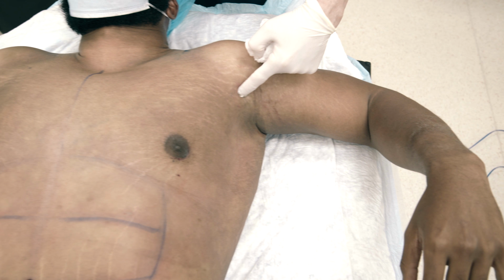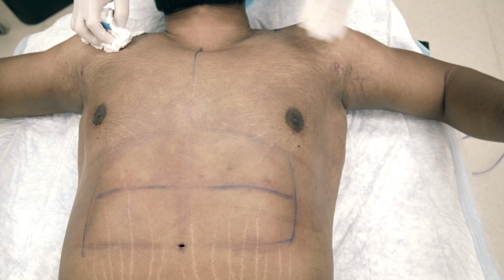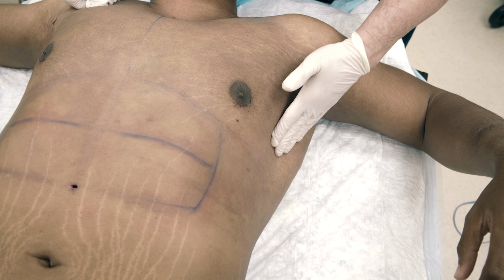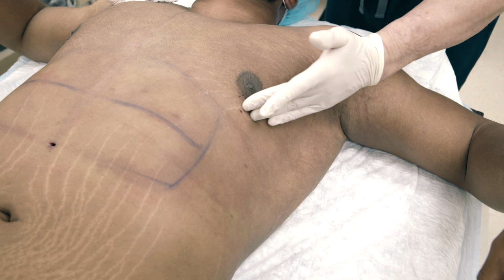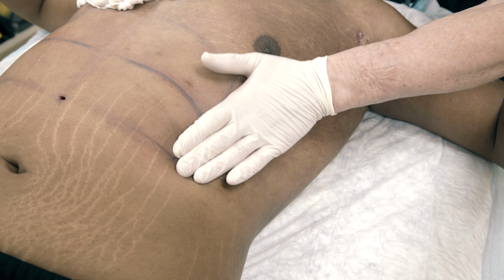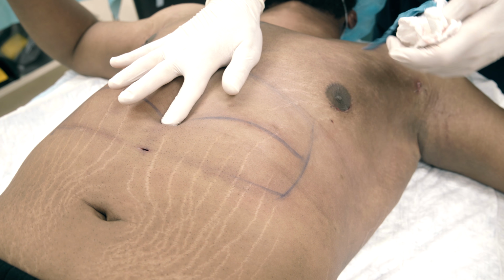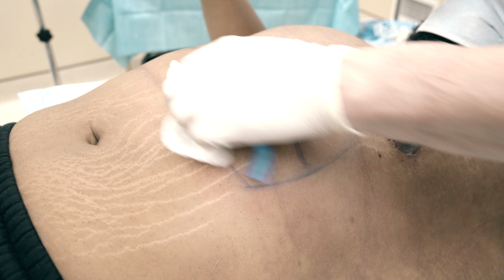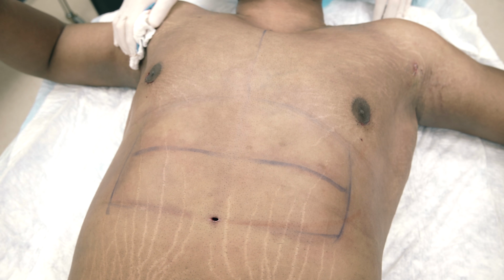My stealth incisions, one here, one here, one here, one here, and finally one there. Did the deltopectoral groove, went down. You can see this great negative shape. He's still swollen. I used almost 4 liters of fluid for him, but these are the lats back here, negative space here, the lateral and inferior aspect of the pectoralis major muscle. Went on down here, the semilunar line over here, and then the upper 6-pack, linea alba right there, and the 6-pack 1, 2, 3, 4, 5, 6 we didn't do. But this is my extended gynecomastia surgery.